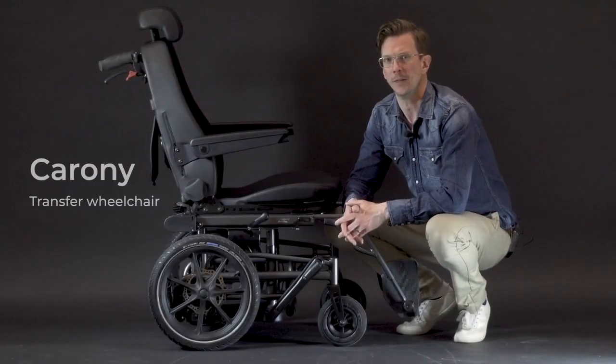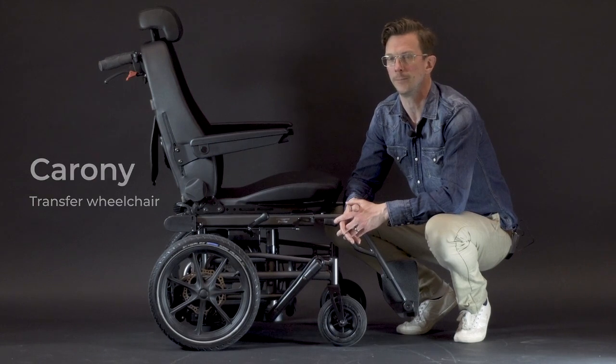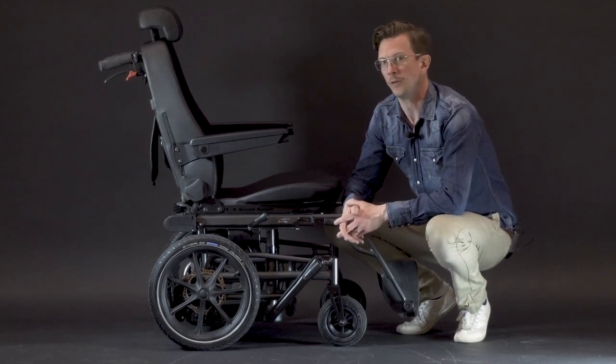This is the Carony — the system that lets you transfer from wheelchair to car seat without lifting. In this video we're going to take a look at some of the features of the Carony.